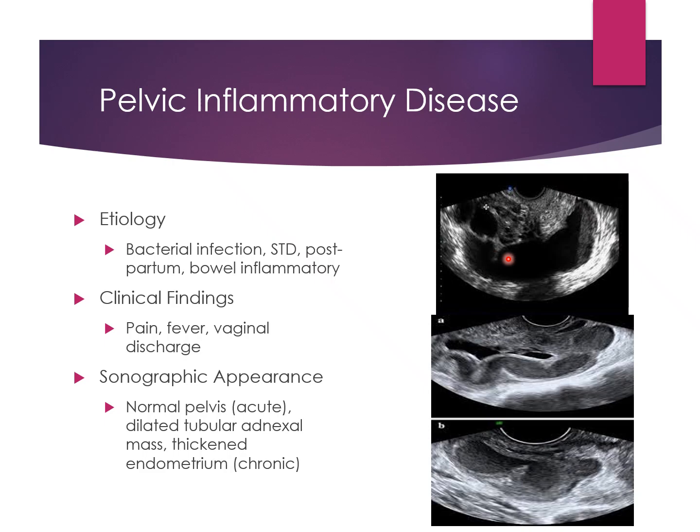And you can see here, I like to call it the muscle man. Anytime we have anything going on with the fallopian tubes, you can see your uterus here, and then the muscly bicep arm coming off of it in a tubular fashion. We got the same thing here. And then here again, that fallopian tube is nice and inflamed.